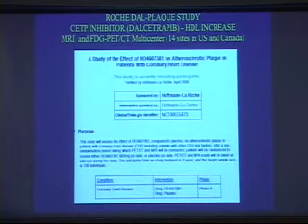In terms of the field itself, in terms of the use of MRI for atherosclerosis as well as FDG PET, what we have lacked today really is large studies that are done in a multi-center setup. There's a lot of single-center work, but we just finished recruiting for a study of the effect of a CETP inhibitor that is supposed to increase HDL and lower inflammation. This is a multi-center study done in the US and Canada using MRI and FDG PET, the same technique as I showed you here. So really we are putting the whole experience that we have within these 14 sites. So far, the result I don't know, but at least the experience has been good, both in performance of the MRI and the FDG PET.